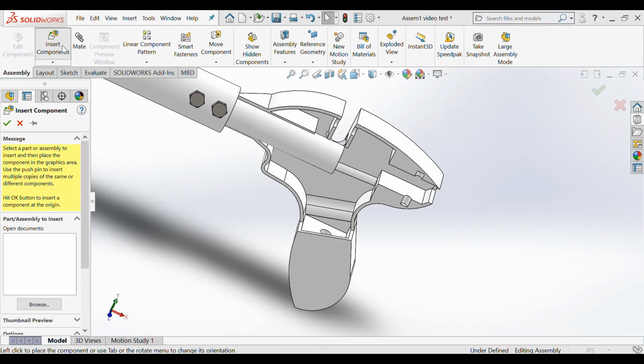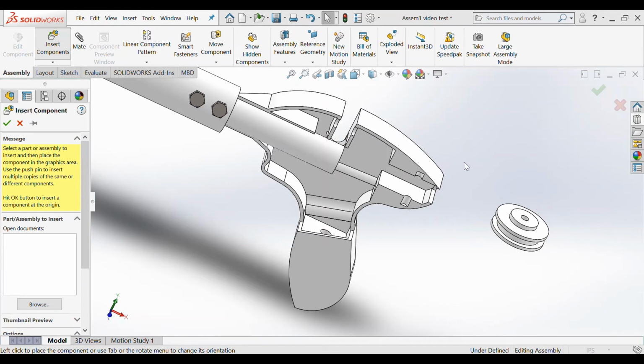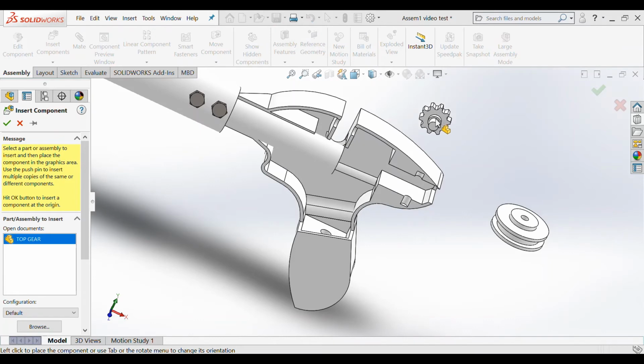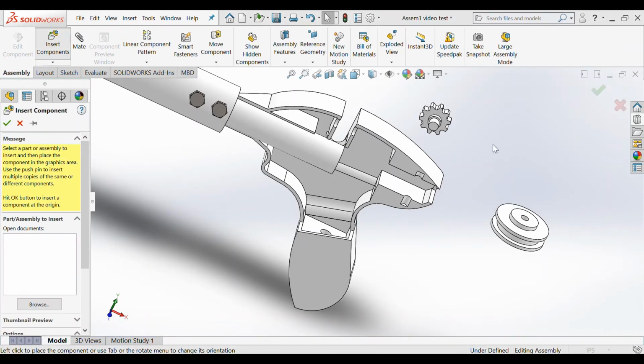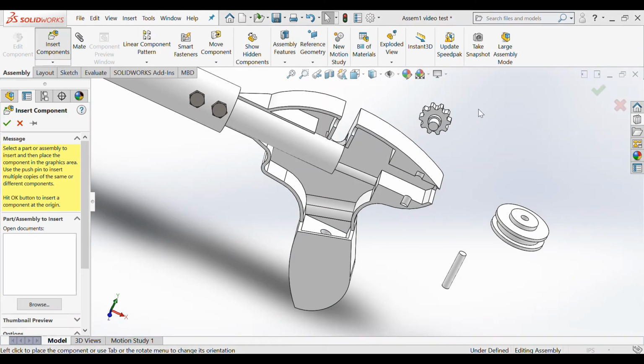So I'm going to go ahead and insert some more components. I'm going to insert what's called the side dial. The top gear. And right now I'm just inserting all of these components, and this will allow assembly to be much faster. I'm going to insert the axle. And the inner gear.